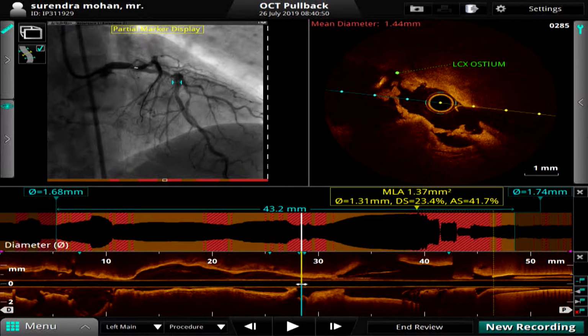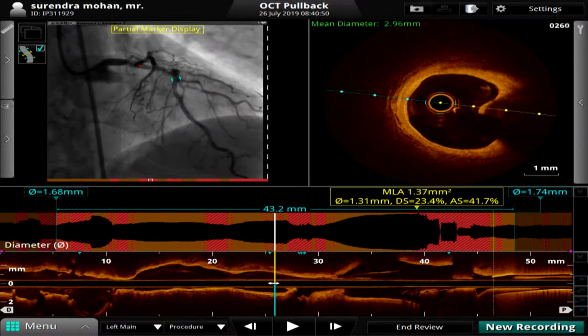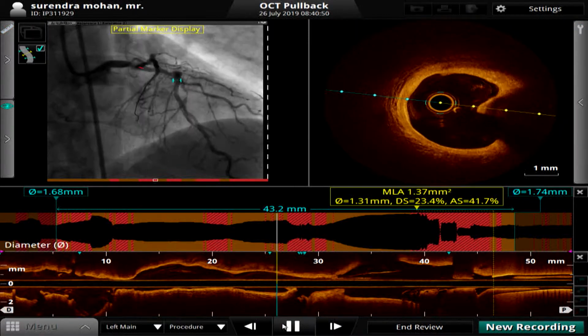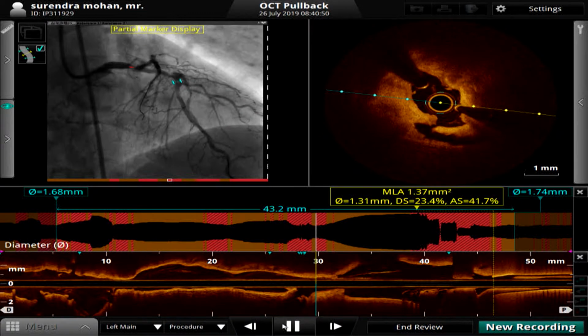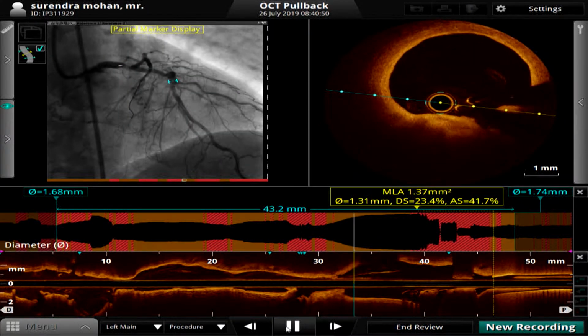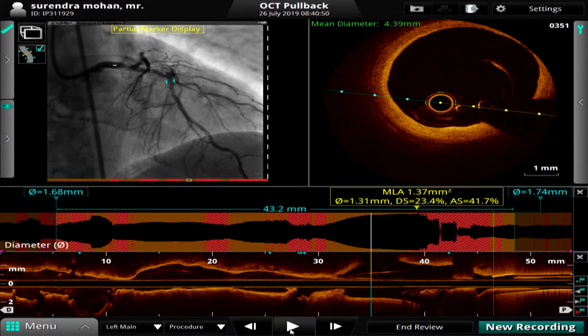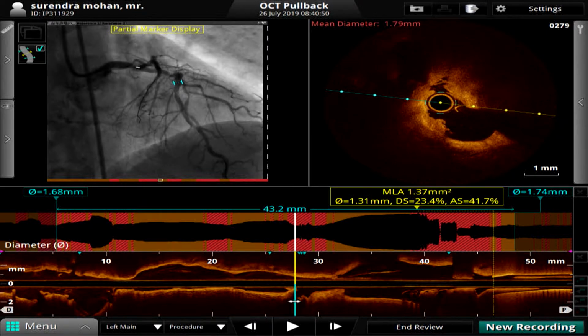I don't know if you can tell. I mean, typically with the left main, to really tell what's going on at the ostium of the circ, you need a separate run down the circ, and that's true with IVUS and OCT. You'll get a sort of sideways look at it, but you can't fully tell what's going on. Okay, but angiographically also the ostium of the circumflex is involved. Here also in OCT it is there. I didn't do OCT from circumflex to left main.